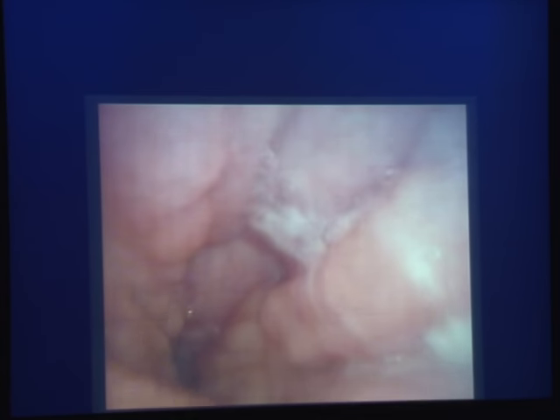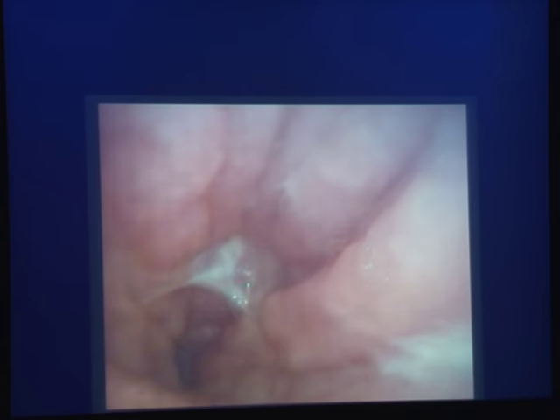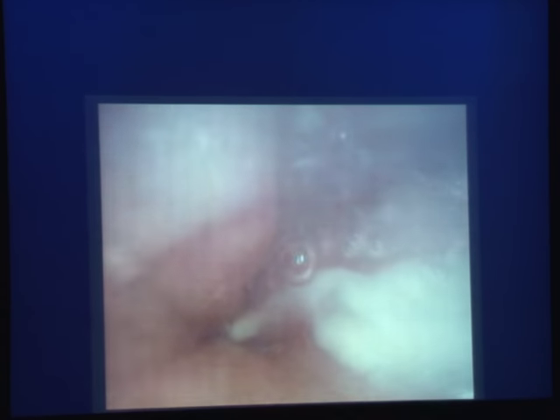See the saturation, 30. So even with falling to dangerous levels of desaturation, the events are counted equal to 4%, 5% desaturation.